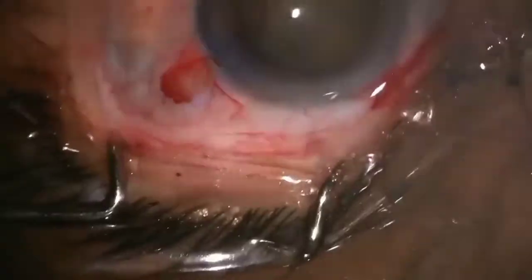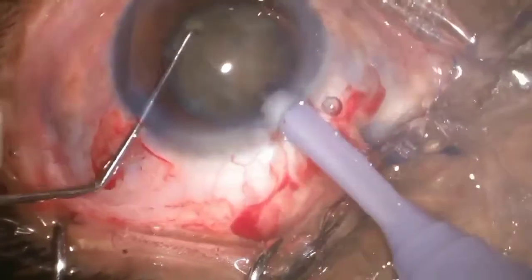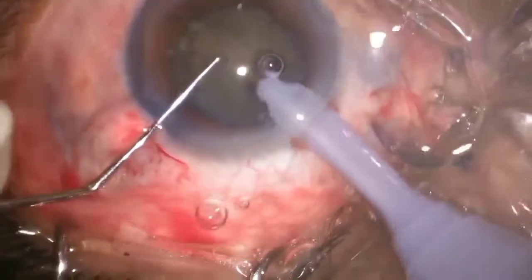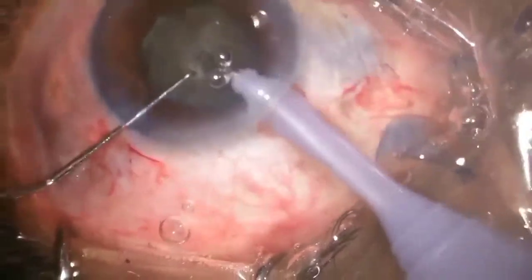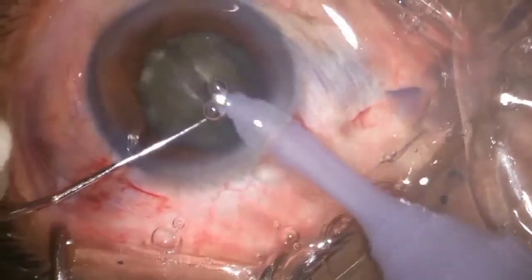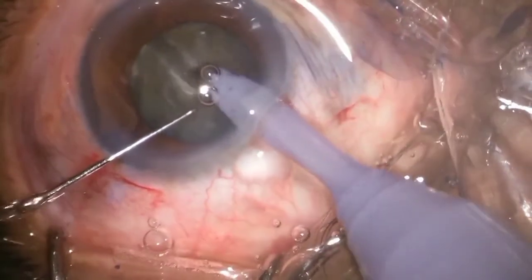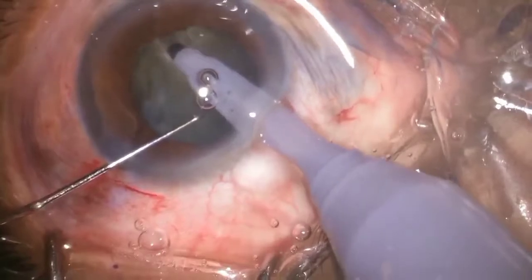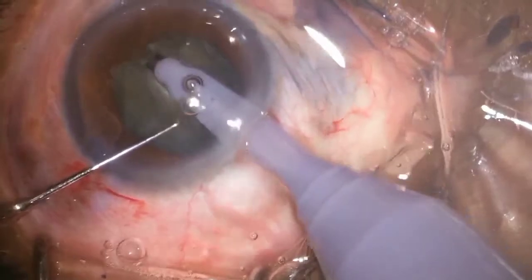Now I was using a low-rate phaco machine. So prior to insertion of the probe, I adjusted the probe in the lower sleeve. Since I was using the lower phaco machine, my power for trenching was 50. I was planning for divide and conquer. Now since it's a hard cataract, the mistake I made was that I should have used the dialer to hold the nucleus at the periphery so that the nucleus becomes stable and it becomes easier to do the trenching. But I was not doing it. Instead, I was doing trenching mainly superficially.